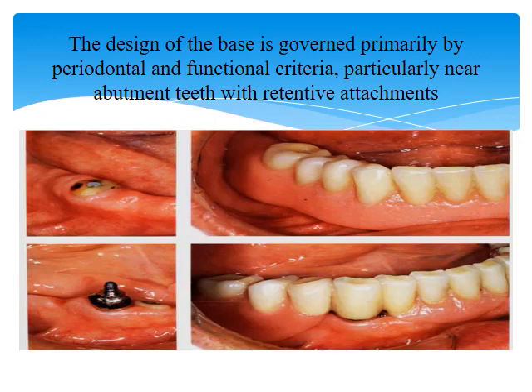The design of the denture is governed primarily by periodontal and functional criteria, particularly near abutment teeth with retentive attachments.